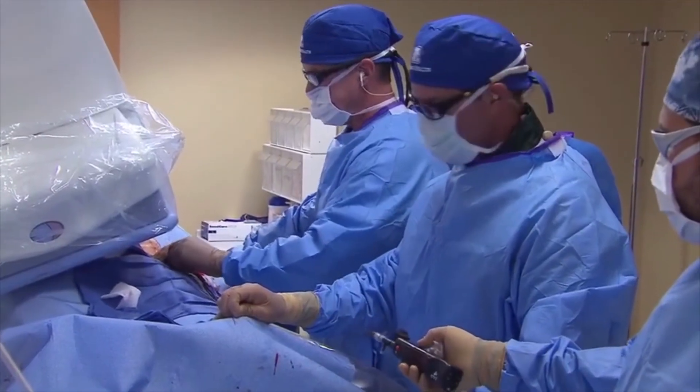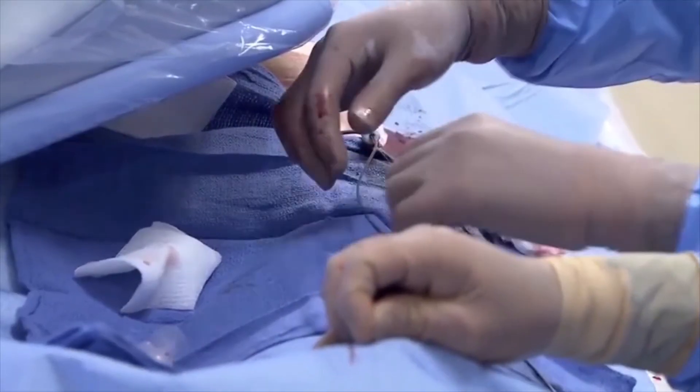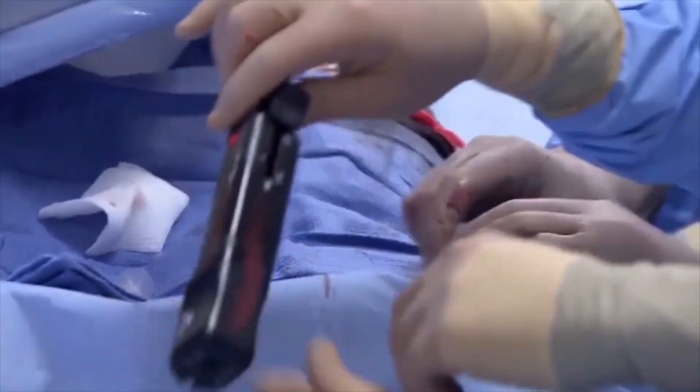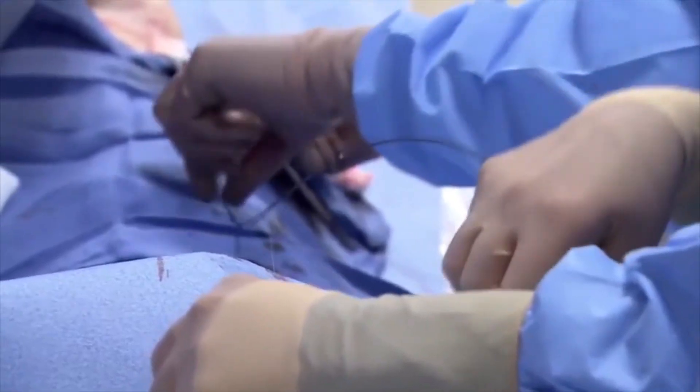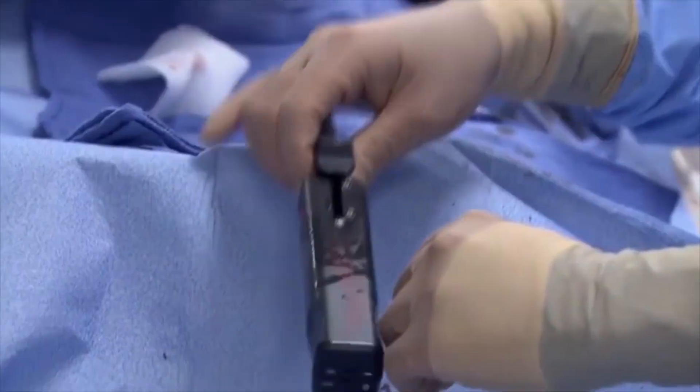Dr. Tonkin is advancing the atherectomy device back through the sheath he put in earlier. You have to make sure the blade is inside the atherectomy device and that you're not cutting the sheath itself. Once he gets it in position we're going to go to live fluoro and see him pass the catheter down through the area of abnormality, which you can see at the upper two-thirds of the screen. On the live fluoro you can see Dr. has turned the little notch out lateral in the vessel, and we're going to get it poised.